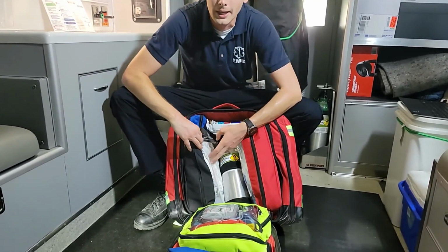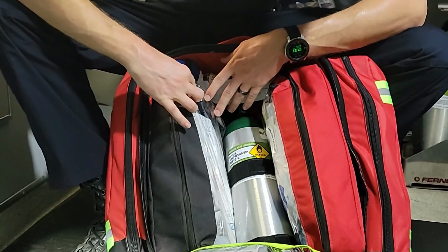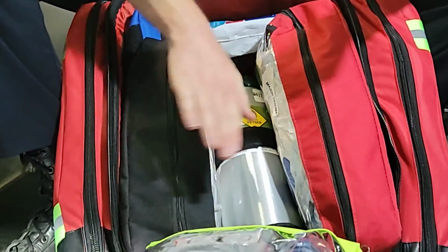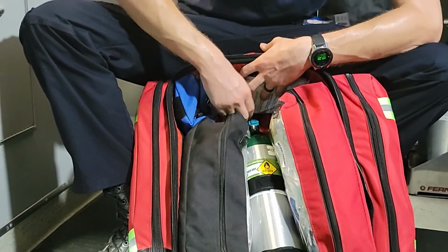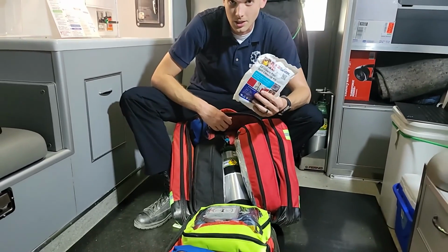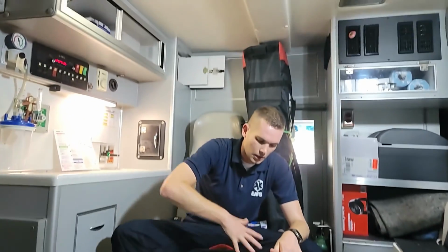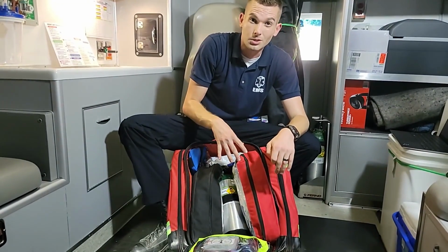This is my airway bag. So I've got suction, I've got a BVM, and some non-rebreathers, nasal cannulas, things of that nature. This is the regulator for the O2 tank, and an easy spill cleanup kit, just in case things get messy. So in here, you can tell if I open the center compartment, it's gotten pretty bad. This is where we're going to get some major trauma. Something serious is going on.